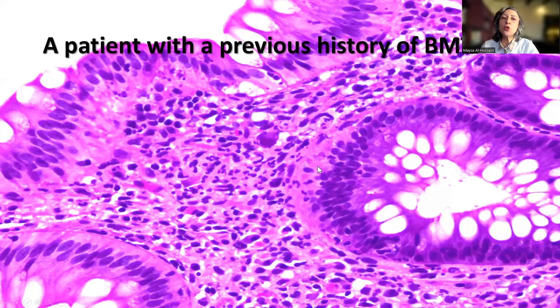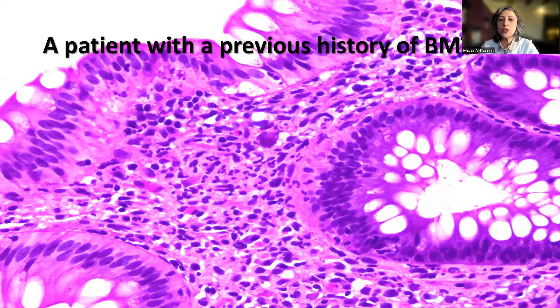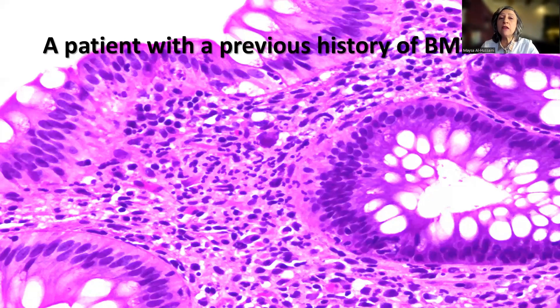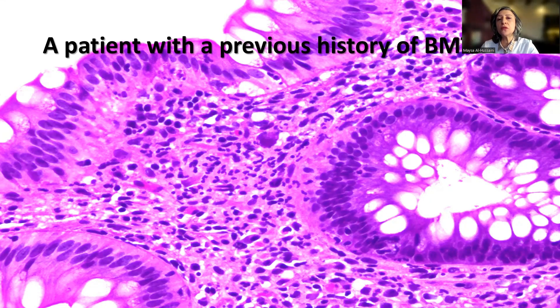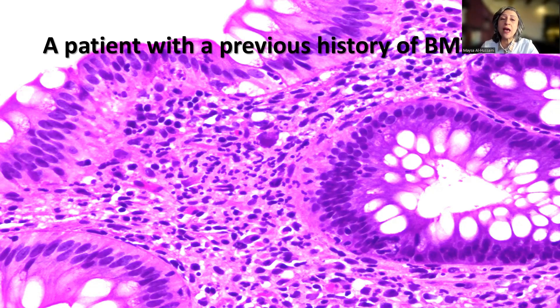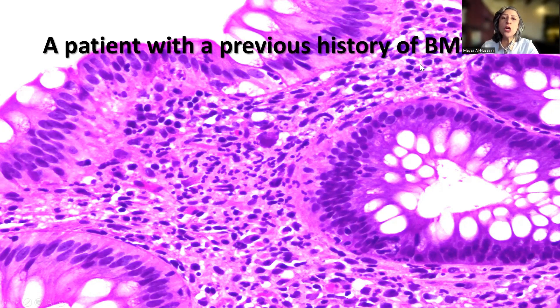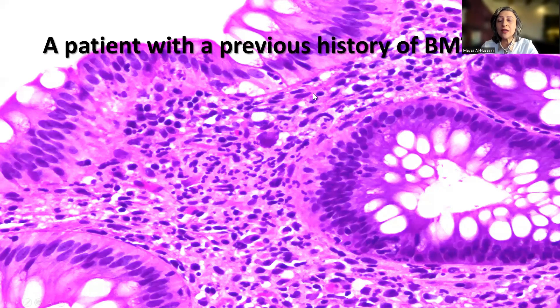This second case came from a patient with a history of bone marrow transplant. Patients with bone marrow transplantation tend to get prophylactic CMV treatment medication. Because of that, if they get activation of the CMV, you don't really see the full-blown picture of CMV-infected cells — the enlarged cells, the cytoplasmic inclusions, the nuclear inclusions, as I just shared with you. What I do routinely in practice is perform CMV staining on all colonic or gastrointestinal biopsies for any patient with a previous history of BMT.